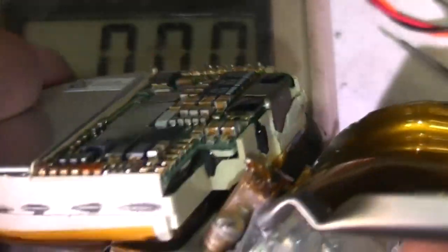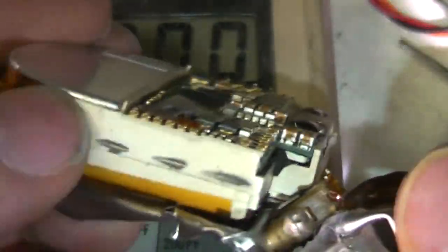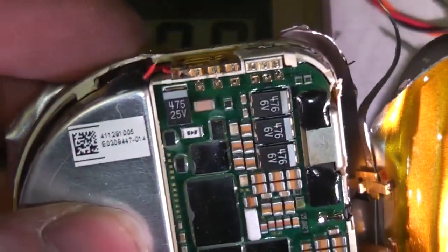Just going to try and dig some of this plastic away. This bottom section is pretty well glued down, so I'm going to try and hack all this plastic off, because I think this PCB is stuck down as well, so it might take a bit more digging to get further into it.